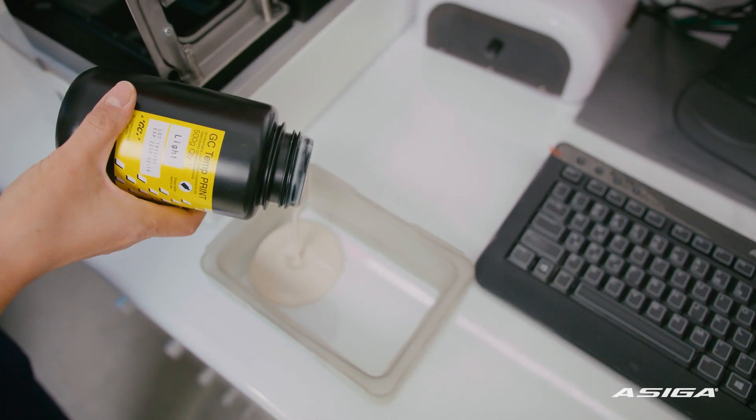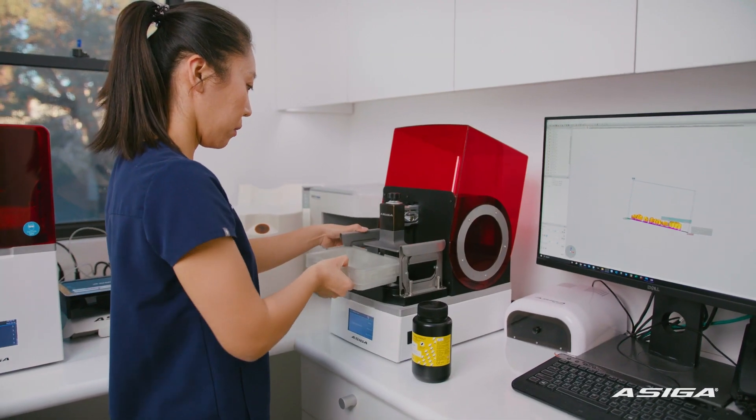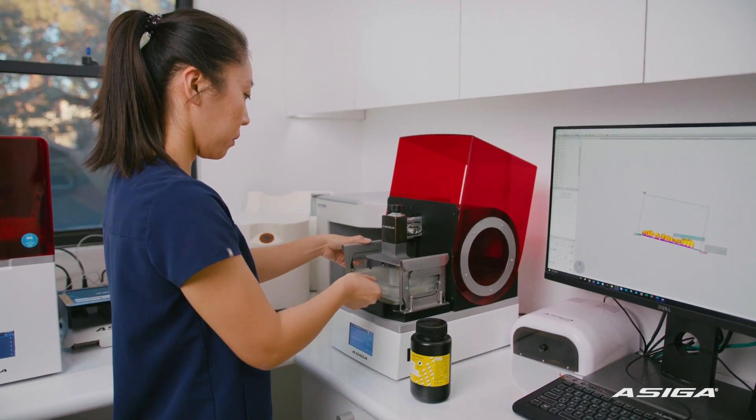Asiga is renowned for its accuracy — it just delivers exceptional quality. That's something that is so important for us: reliability.